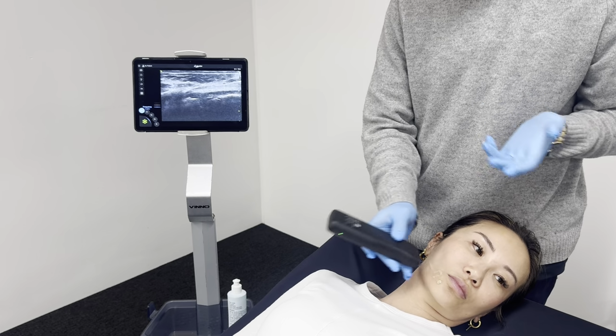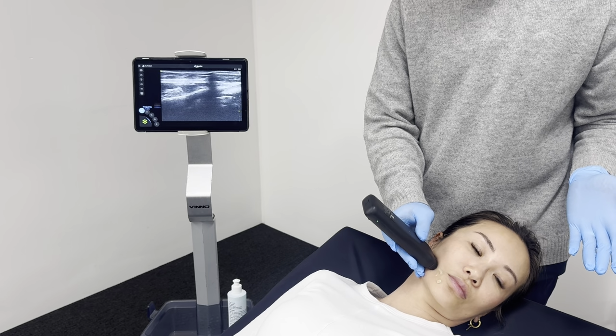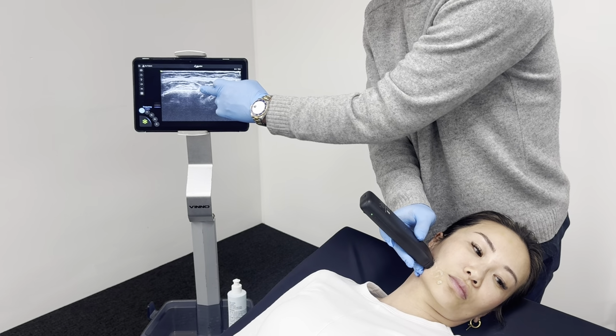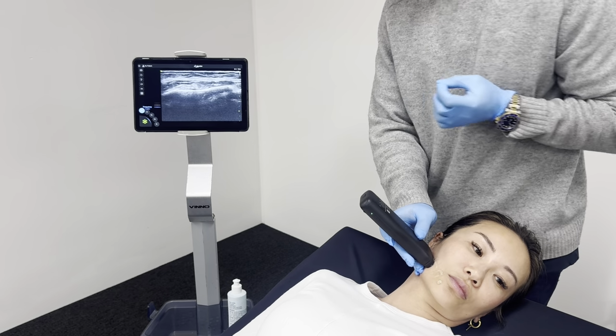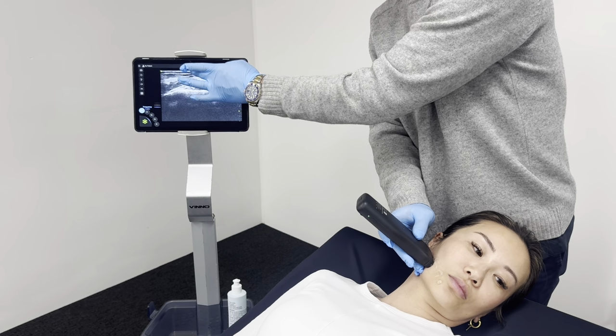So here we are on the lower part of the face, in line with the mandible. If we come posteriorly back up towards the ear, we can see the masseter muscle. So we have the mandible, this white bone at the bottom. Anything that's reflective of sound waves is going to appear bright. We have the muscle above it, and then we have the SMAS layer above that, so that's that thick white connective tissue, and then we've got the subcutaneous fat.